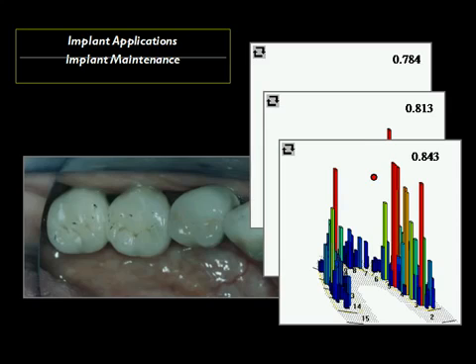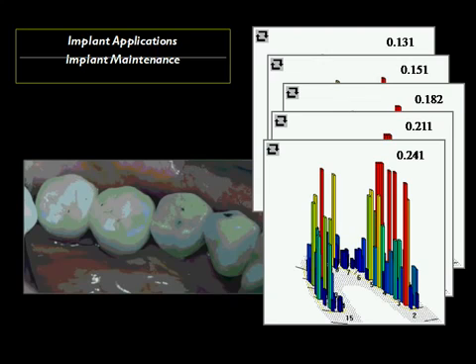As I play it forward, finally we get contact on natural teeth. But in fact, it's delayed. The natural teeth are contacting after the implant. So we make another adjustment. The adjustments result in this occlusal scheme where you start to see now more contact on the cuspid, contact on the natural crown of the first bicuspid, but still contact on the implants.